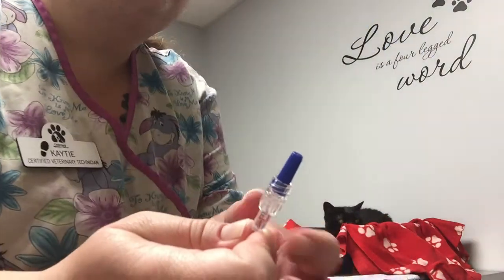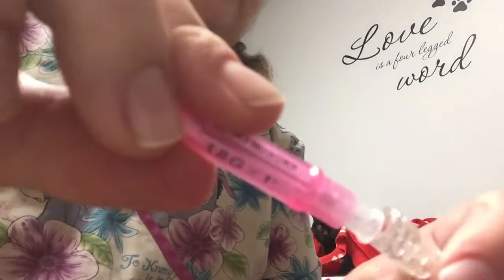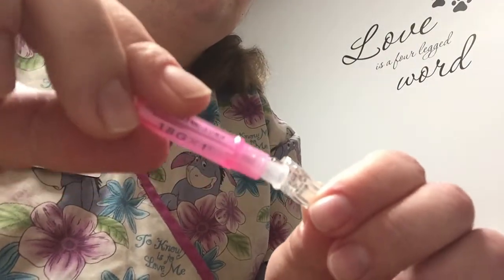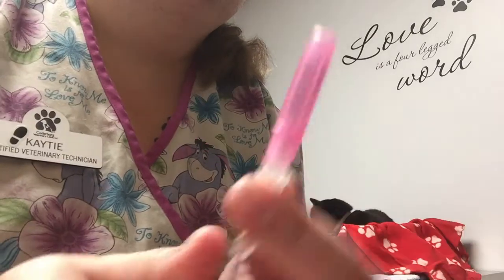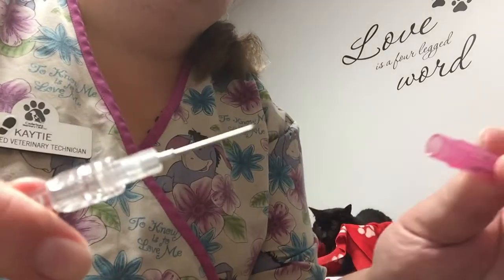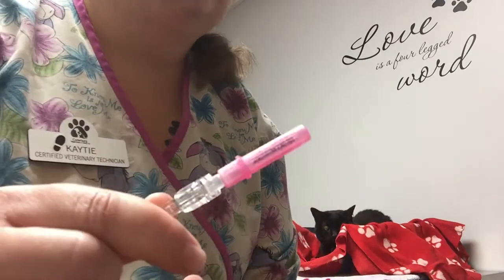There's a little blue cap on the end of the IV line — just twist that off. Then twist the needle on. That way you can take the cap off and put it back on without having to remove the needle.